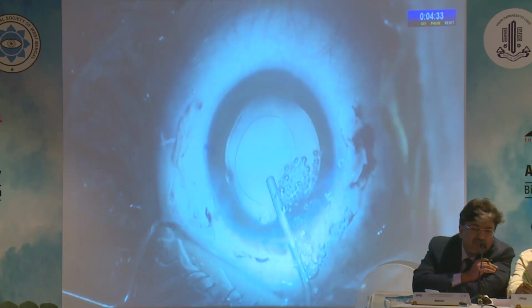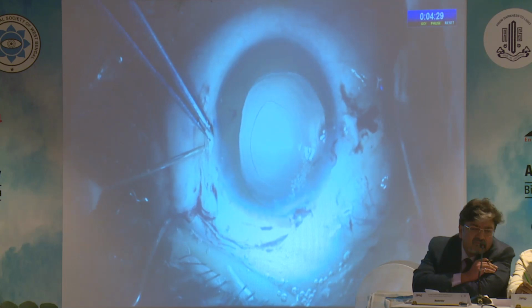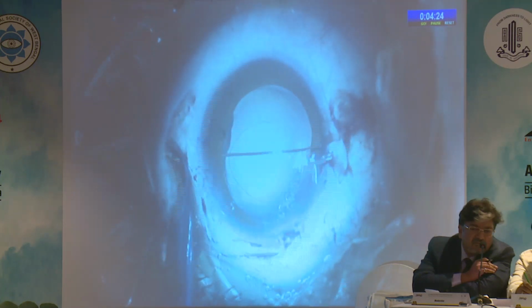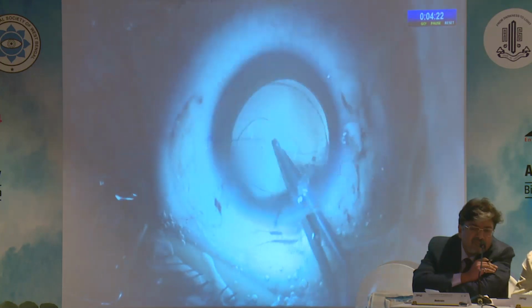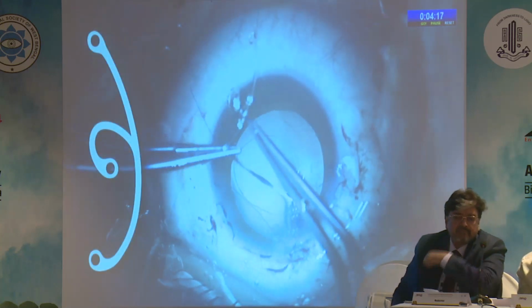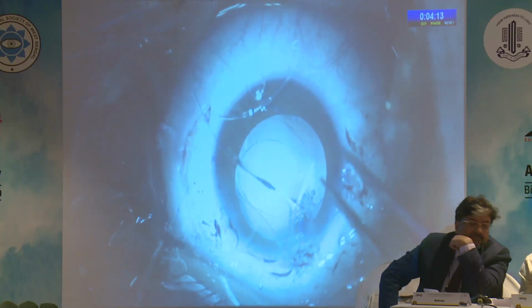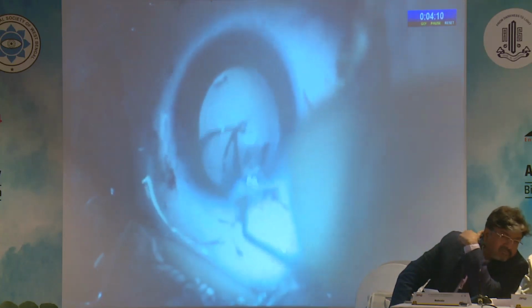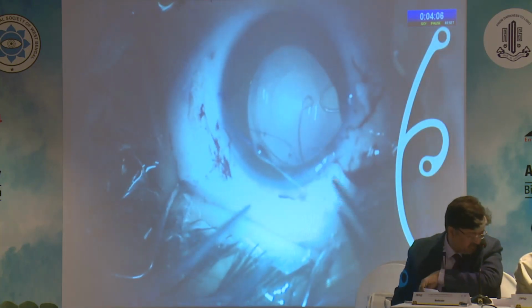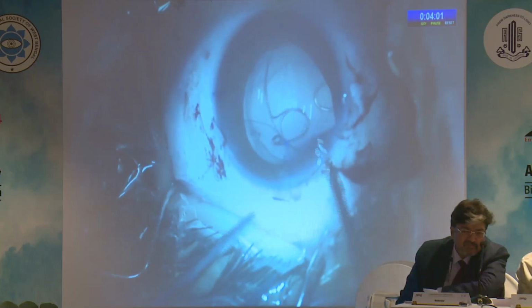The bag is then inflated with viscoelastic and 9-0 polypropylene suture is docked into a 26 gauge needle and railroaded through the other end. Now here the capsular tension segment is being placed carefully through the main port incision after being threaded by the 9-0 polypropylene suture. It has a leading eyelet, a trailing eyelet and a central eyelet that is being used for fixation. Each segment provides 120 degrees of support, so 2 CTS provide 240 degrees of support to the capsular bag.